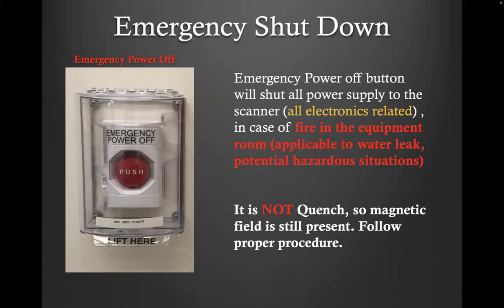Okay. And this is not a quench. So the magnetic field is still present, so you should follow proper procedures by acknowledging that the magnetic field is still there. Have your doors always closed. And then this is in case of fire in the equipment room, or it will be applicable to water leak potential or other potential hazardous situations.